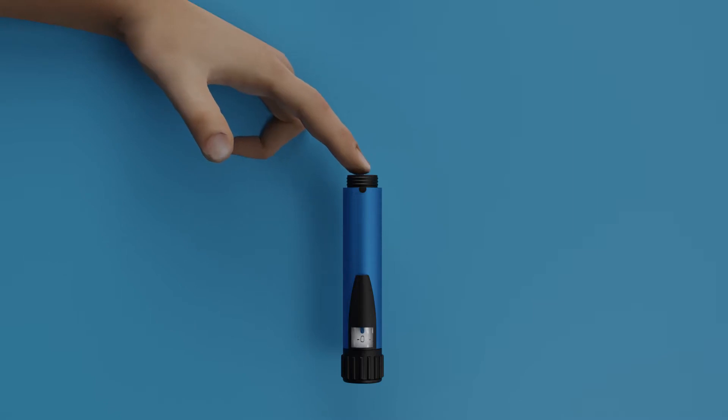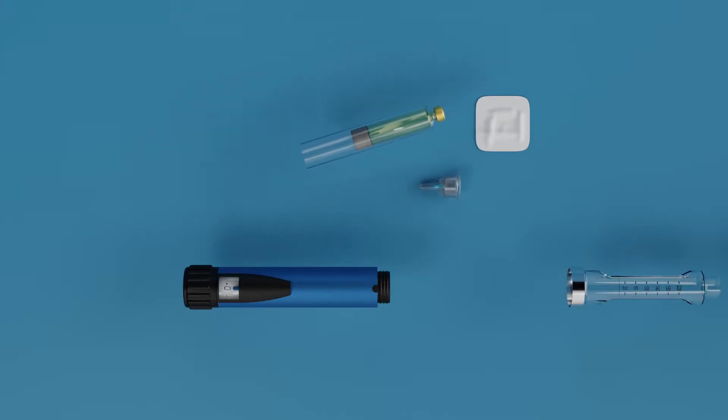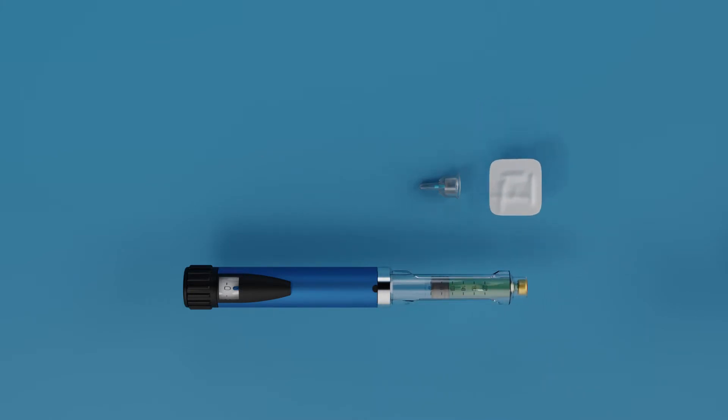Load the cartridge with the metal cap before the further procedure. Screw the cartridge holder and the pen body firmly together. Clean the cartridge holder head with the alcohol swab.